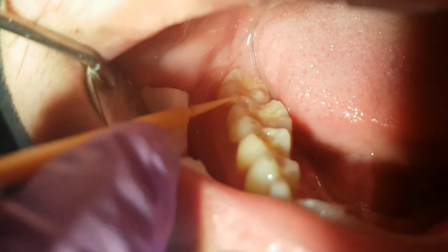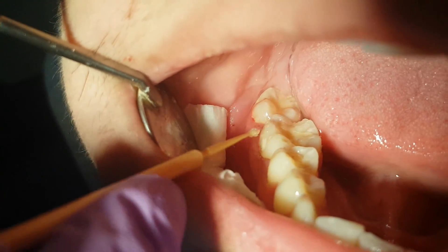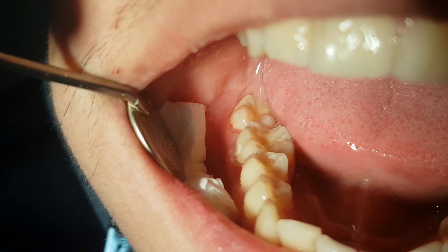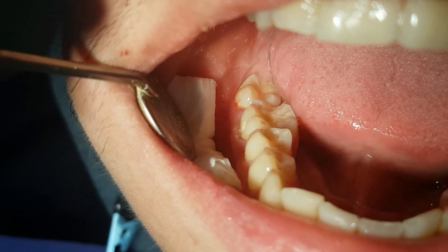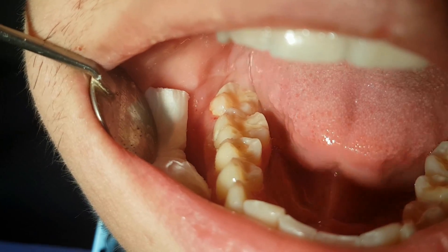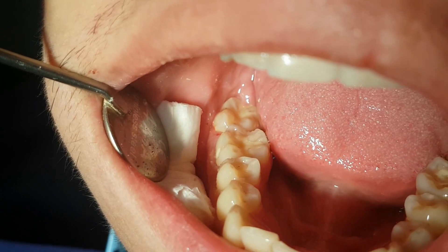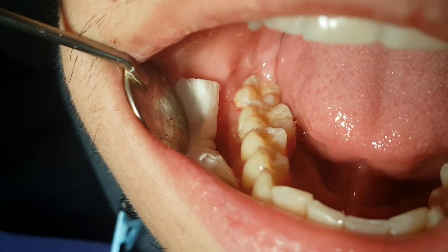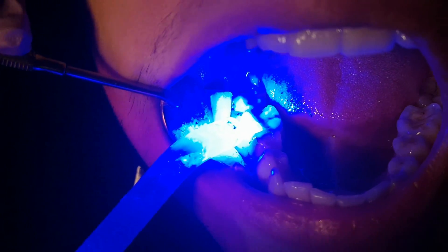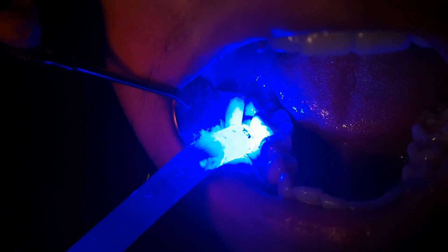Last, we apply a diamond bond so the hygroscopic characteristics of the filling we applied are preserved. We dry it out and then use a Helio lamp to cure the bond.